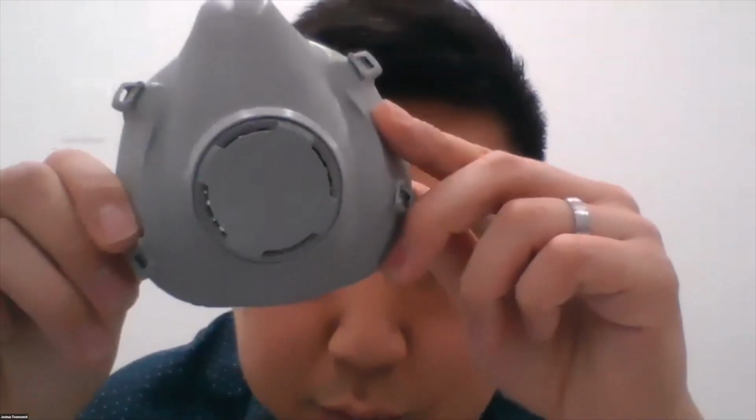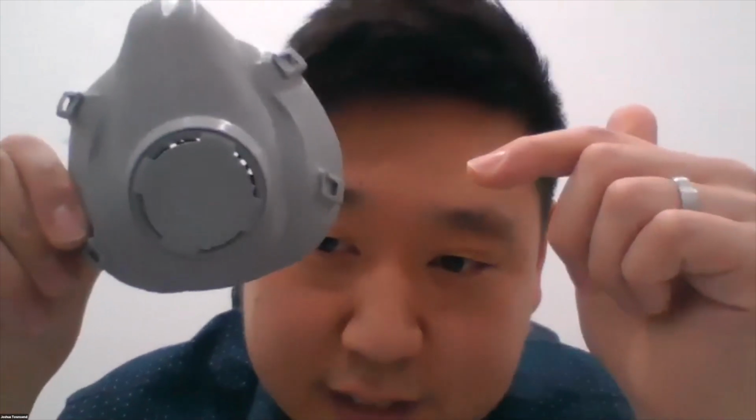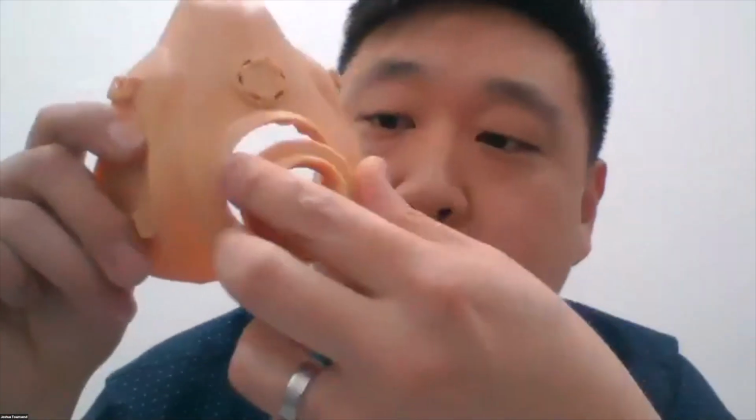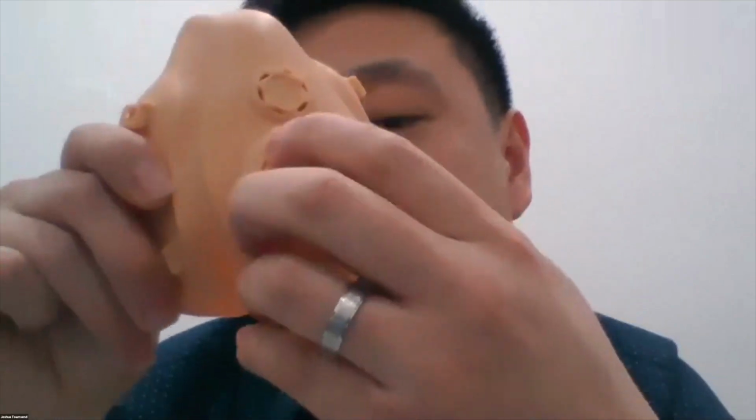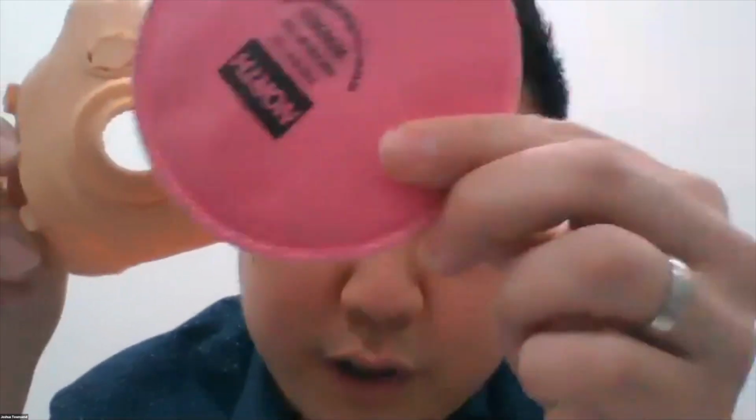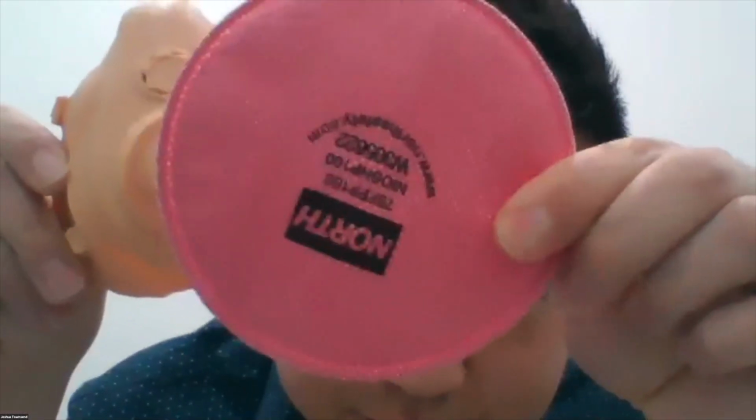One of the concepts was that we wanted to offer different cap attachments for different filters that were available in the market. So that was my very first face mask design. Now, if you look here, we have a different filter attachment. And what this would offer is an attachment for one of these P100 filters.